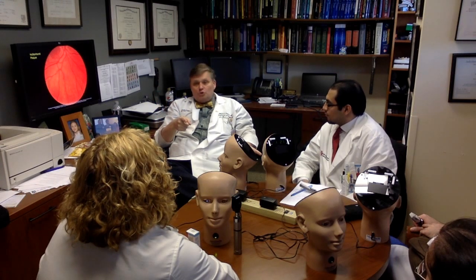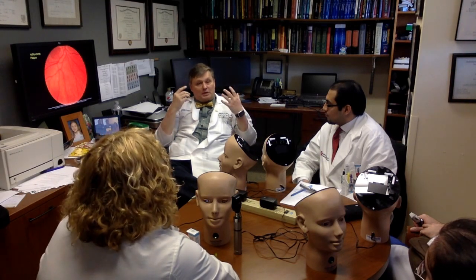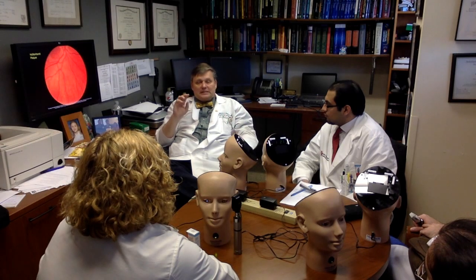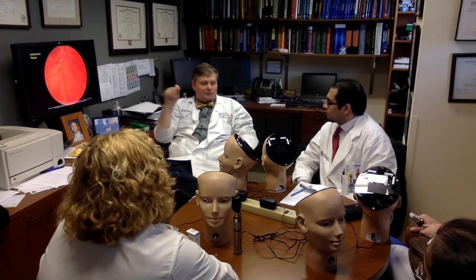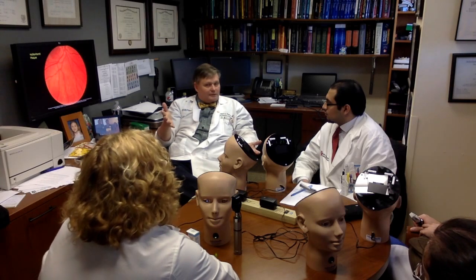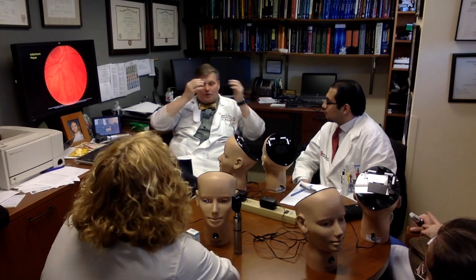Now, you want to use your eye drops and dilate the eyes because you'll get such a better view. As you know, it's night and day. If you dilate the eyes on an inpatient, please leave a note on the bed. Patient's eyes were dilated, it's 8 p.m., by neurology, so people don't freak out. The nurses walk in and it's like, oh my God, the pupils are blown. Call a code. All right, call it back. The pupils are blown.